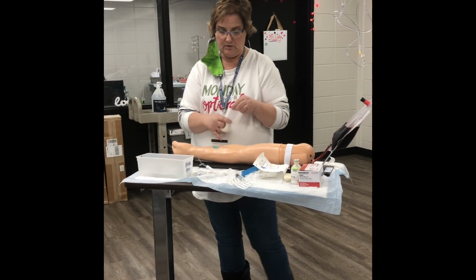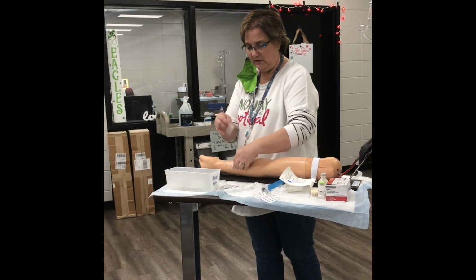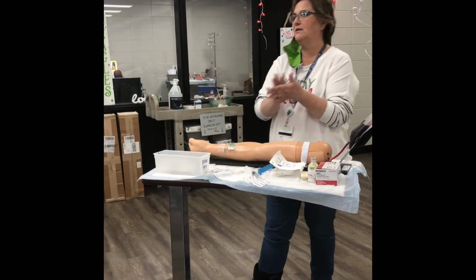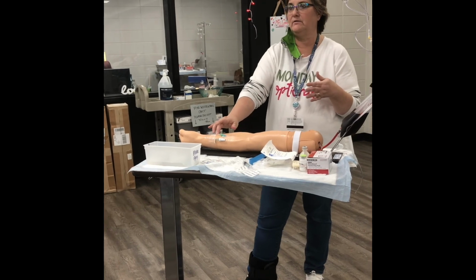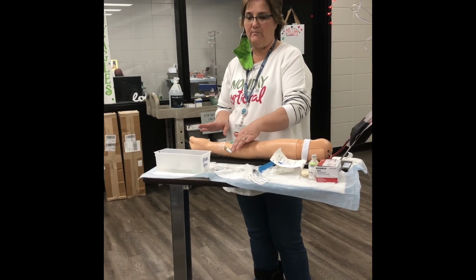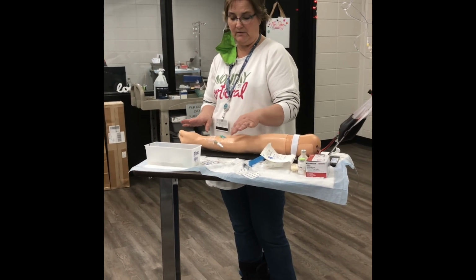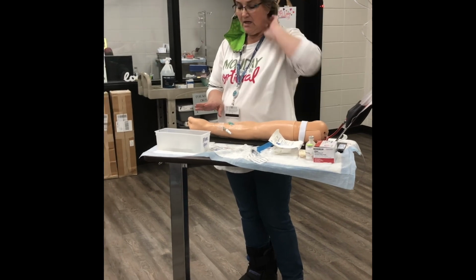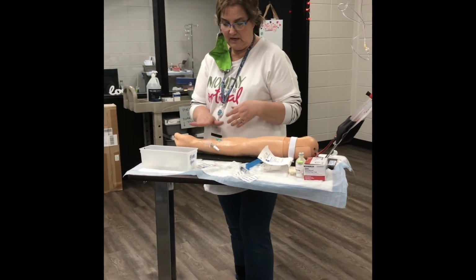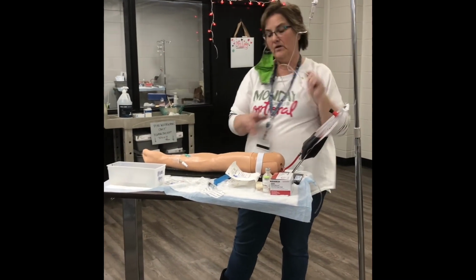I'm going to get this started. If you're going to do it before, all you're going to do is make a loop and put your tape over it so that your patient doesn't pull it out in the bed. There's at least something trying to help it. Now, don't put any paper or tape over this transparent dressing, all right, because you need to be able to see your site to assess it every time. All right, once that's in, we've checked placement by flushing it. We've taped it and secured it with the dressing. We can hook our fluids up.